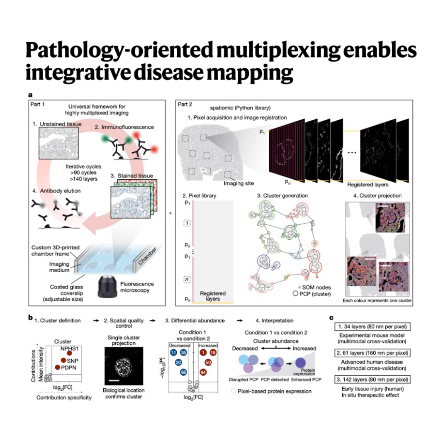They analyzed over 400 regions from those 38 biopsies, generating, again, a massive amount of data, over 100 billion pixels. From that, Spatiomic identified 18 clusters that showed significantly different abundance levels between the DKD patients and healthy controls. 18 distinct signatures of DKD at the subcellular level. Any specific examples jump out? One really interesting one was cluster 19. They labeled it metabolic tubular injury.